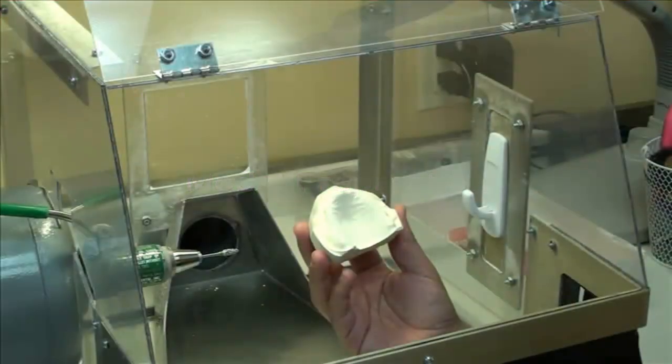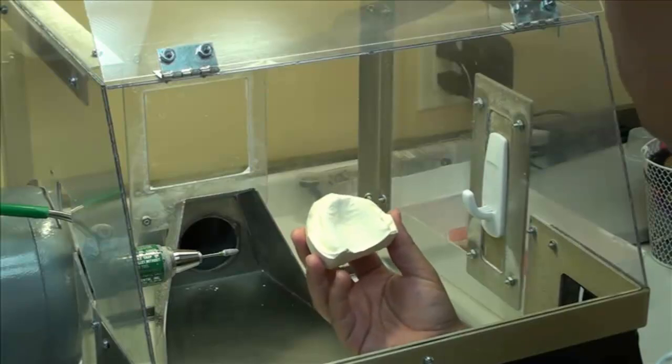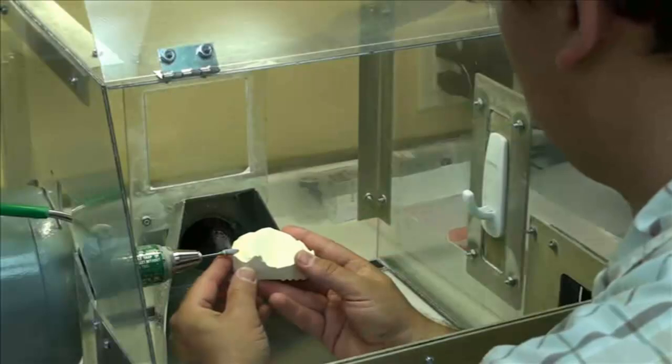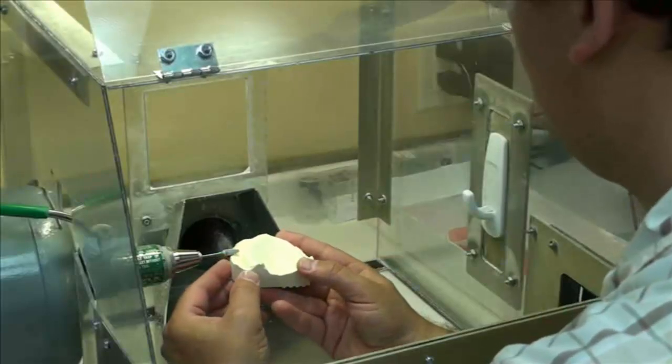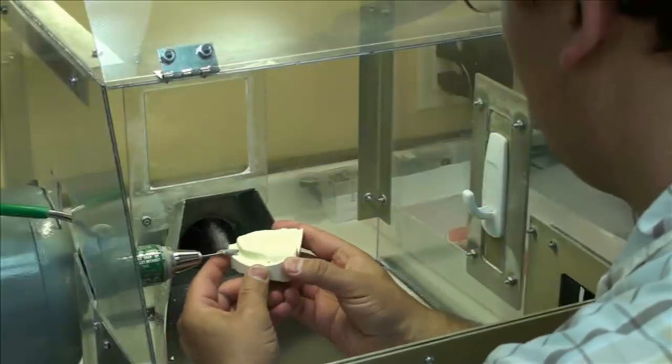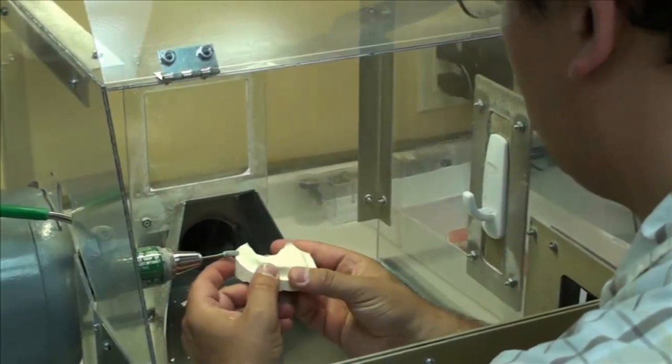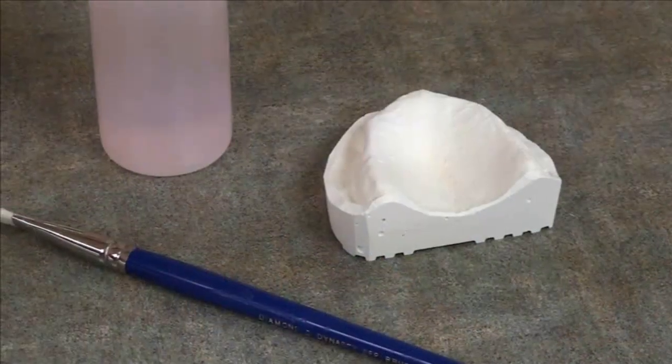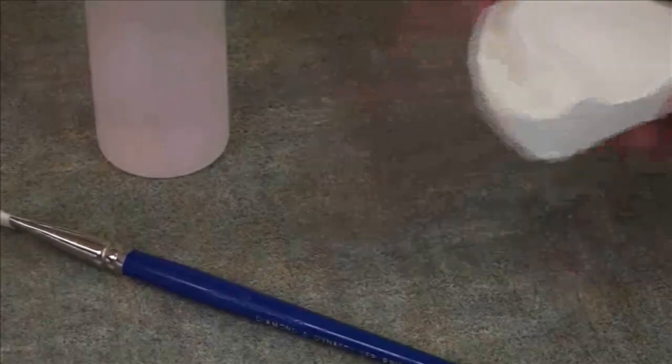Let's begin the review of the FiberForce mesh fabrication process with a look at model preparation. Trim the final working model to ensure all sharp edges are removed. This will be important later when the model is placed inside the splint vac unit. Complete the model preparation by applying a separating liquid and allowing it to dry.